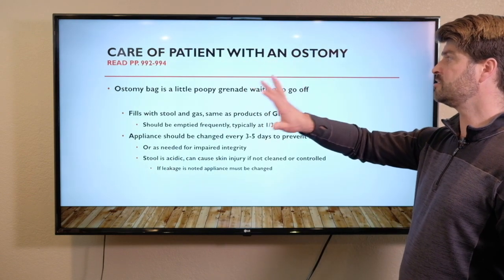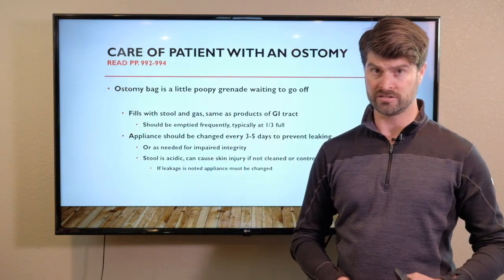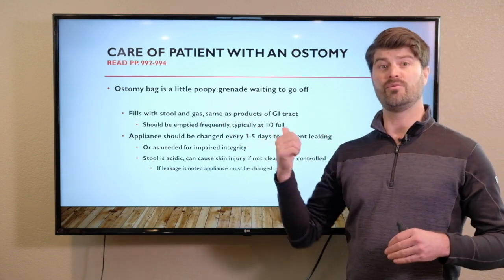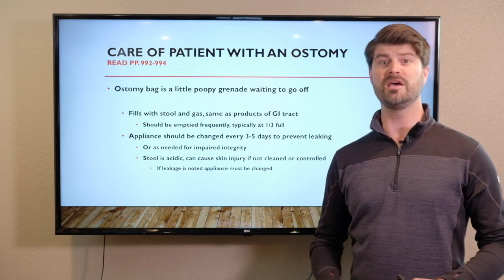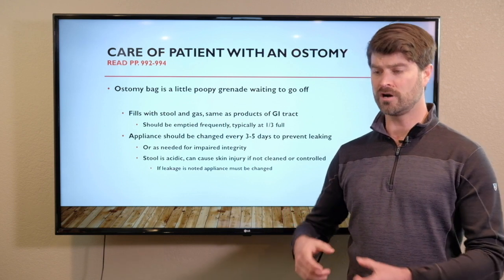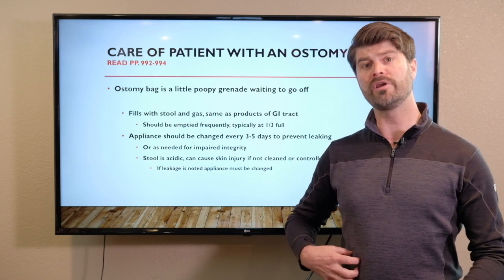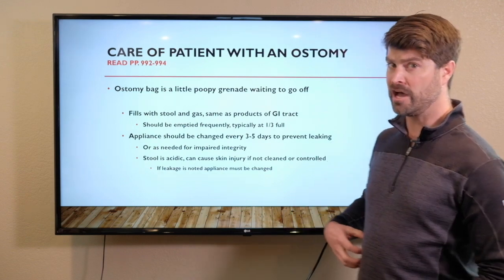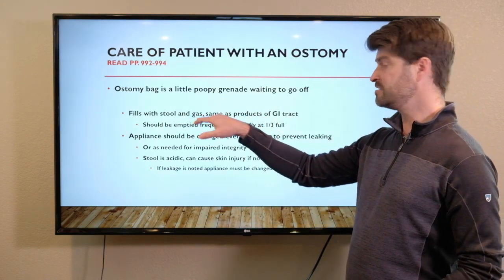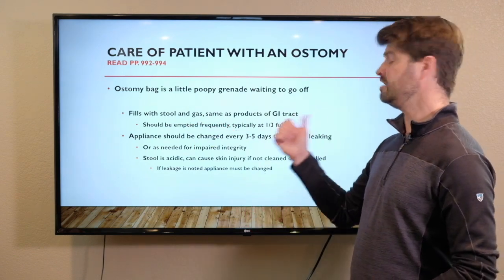So, care of a patient with an ostomy. Here's the thing to note: that ostomy bag is not your friend. It is something that will not look out for your best interest. It will try to ruin your day as many times as possible. These bags are almost like little sandwich-sized bags that are attached to that opening, so they don't hold that much. When these things fill with stool or gas, because it's the bowel, so it's producing both stool and gas, they need to be emptied.